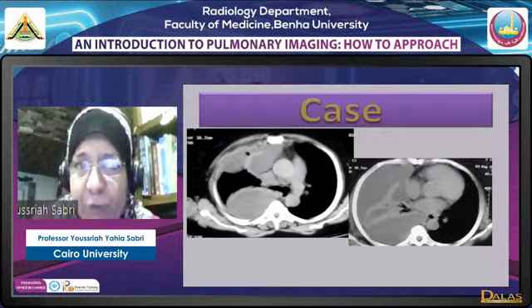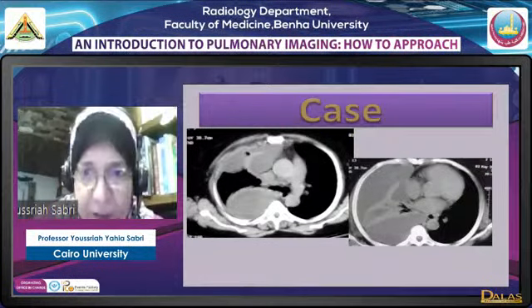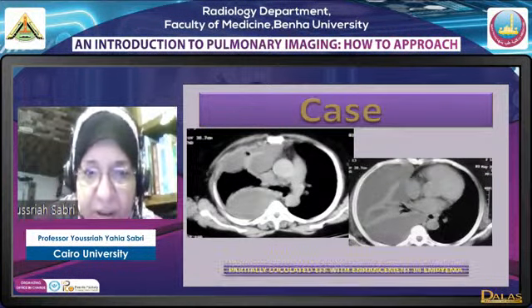Mark you, if you have total loculation of the effusion, even if it is a massive one, you will not have mediastinal shift, considerable mediastinal shift.